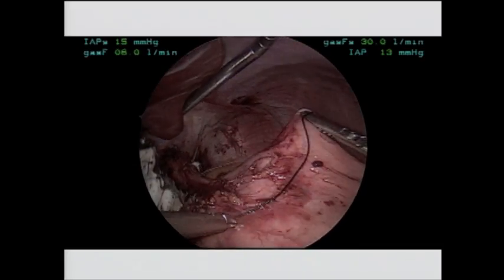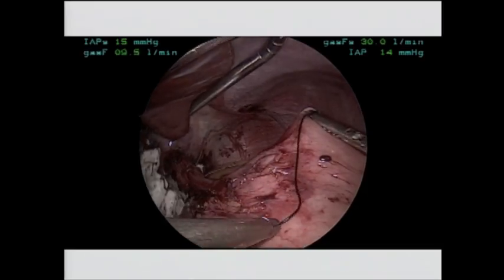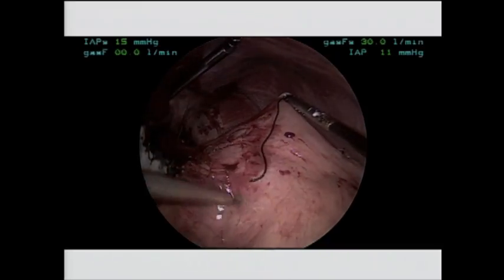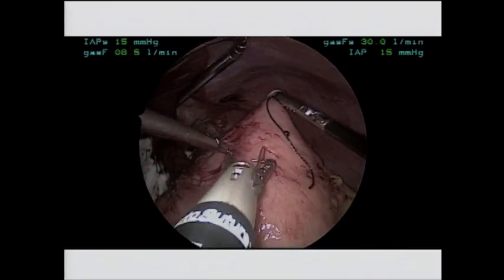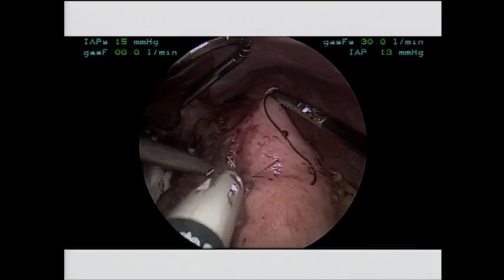And I think what this does is it allows us to accurately calibrate these things. So there we go, back to the starting point, equilateral triangle. Little counter traction, watch where the end of it goes. Wherever the end of it stops there is where we're going to grab and put a suture. And the anterior suture is just a marking point. We don't need to use it to pull anything around. So we're just going to use a short suture.